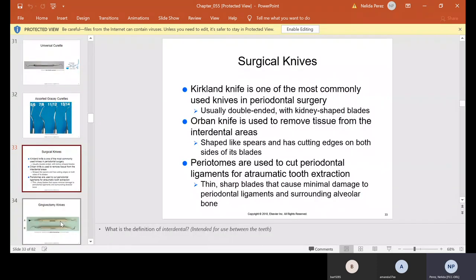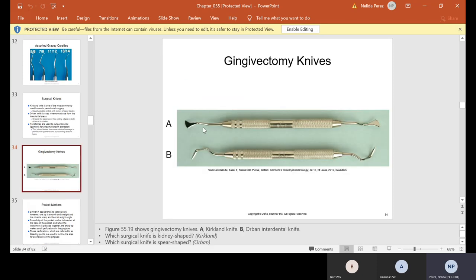Surgical knives: a Kirkland knife is one of the most commonly used in periodontal surgery — usually double-ended with kidney-shaped blades. An Orban knife is used to remove tissue from the interdental areas; it is spear-shaped with cutting edges on both sides of the blade. Periotomes are used to cut periodontal ligaments for atraumatic tooth extraction — thin, sharp blades that cause minimal damage to periodontal ligaments and surrounding alveolar bone. Here are the gingivectomy knives: A is Kirkland and B is Orban; Orban is pointy so it can go in between interdental.